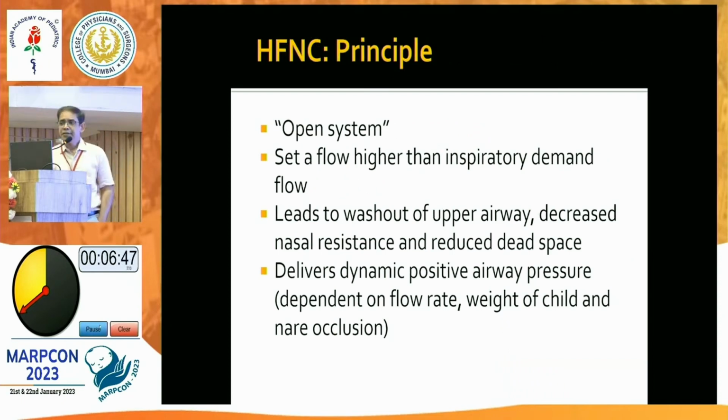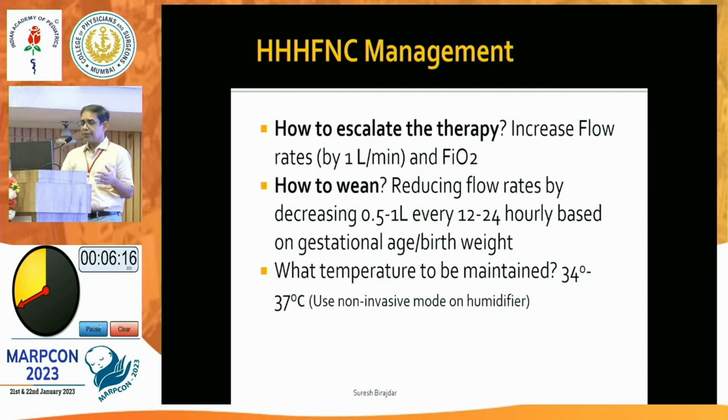So how does HFNC work? Compared to CPAP, which is a closed system, so that's why the nasal prongs have to be tightly fitting. But high flow nasal cannula is an open system. We have to set a flow that is good enough for the respiratory demand of the baby, and it just reduces the dead space. With increasing high flow rate, sometimes it delivers distending airway pressures as well, like CPAP, but it is not reliable and we can't quantify it.